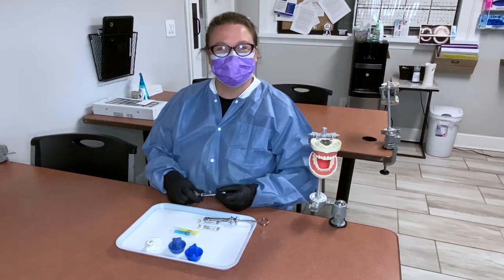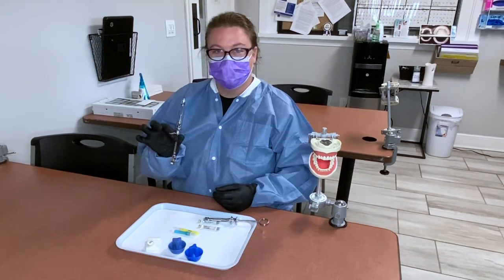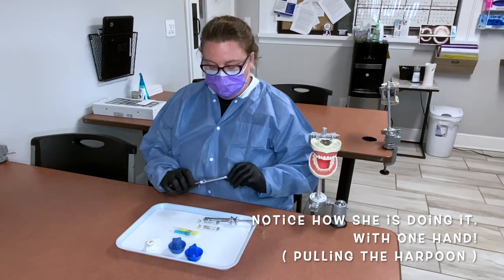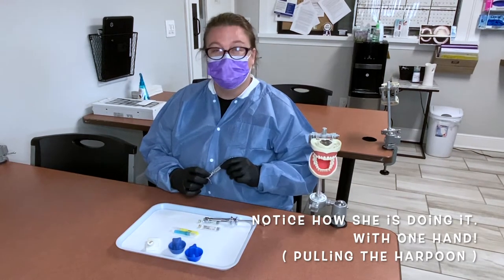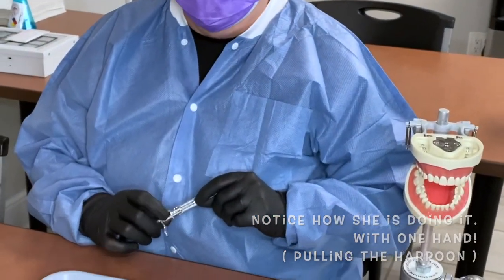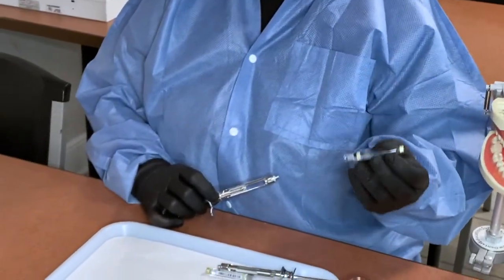So we're going to put our anesthetic in first. You want to watch out for the little harpoon inside — be careful, they're sharp, that's why they call it a harpoon. This is your anesthetic carpule.